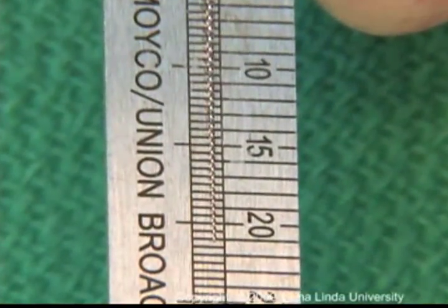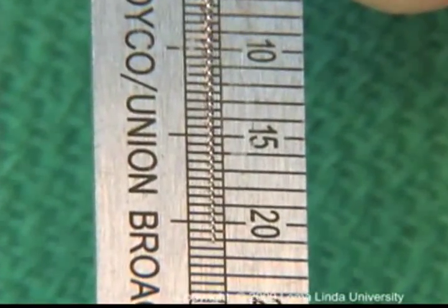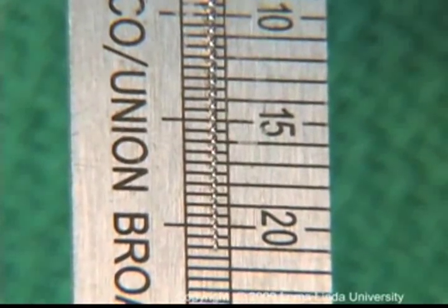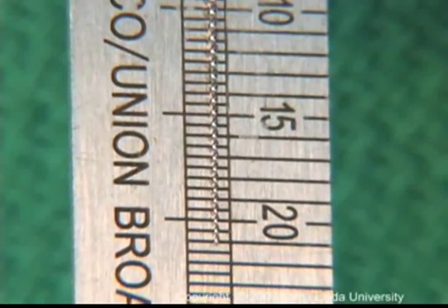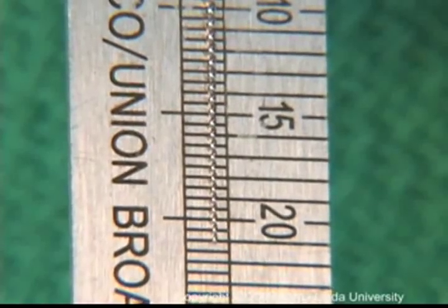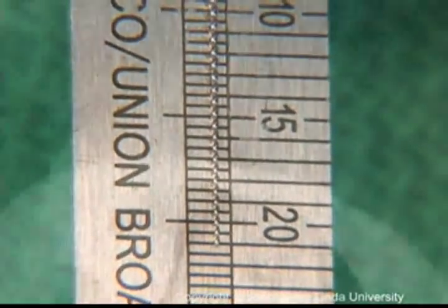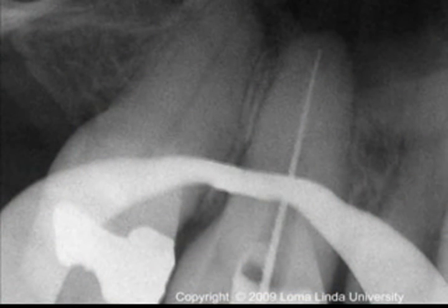After adjustment of the stop, the file is taken out and the length is measured. A sterile millimeter ruler is used to measure the estimated working length. A calculation to the nearest half millimeter should be made. After length determination with an apex locator, the final working length must be confirmed radiographically.